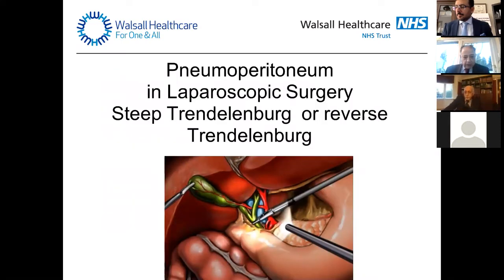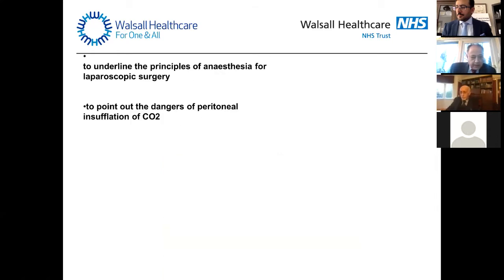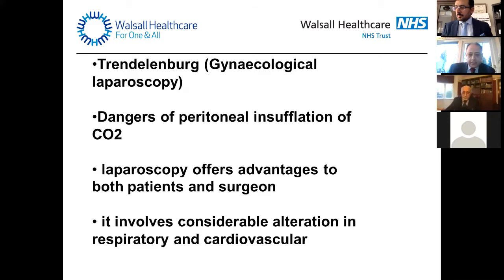So we're going to talk about laparoscopy and the difference between steep Trendelenburg, like major gynecological work, or reverse Trendelenburg, for example lap cholecystectomy and bariatric surgery. And we'll talk about the characteristics of carbon dioxide and how we monitor it in order to alleviate the toxic effect of this substance.